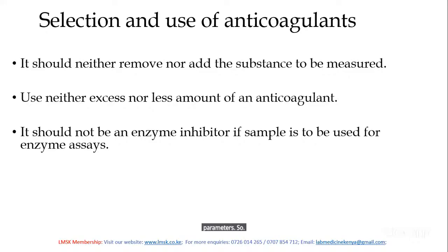So, selection and use of anticoagulants. Make sure that the anticoagulant you use does not remove from the specimen what you are analyzing, and it does not add into the specimen what you're analyzing. For instance, if you're doing electrolytes, potassium and sodium, don't use an anticoagulant which has sodium and potassium like EDTA. It will add potassium and sodium into your specimen.